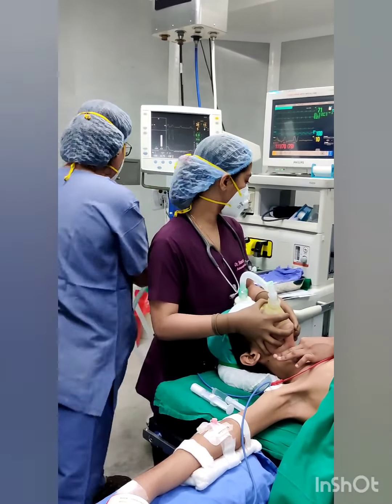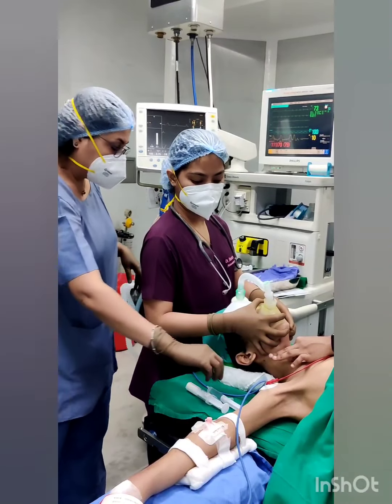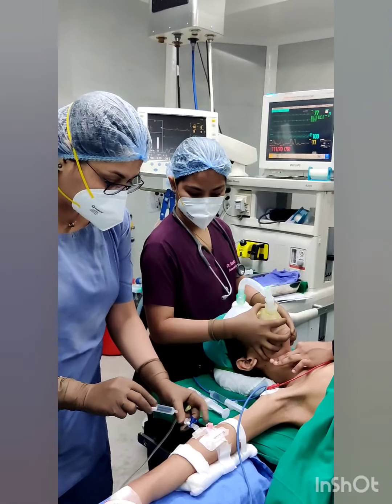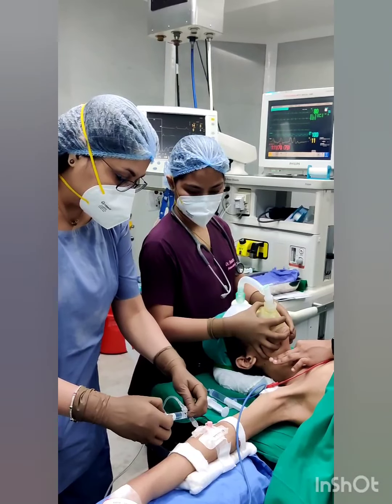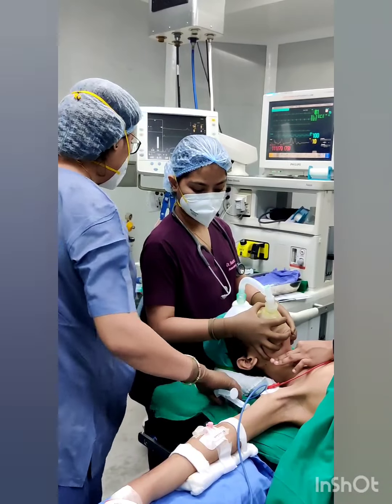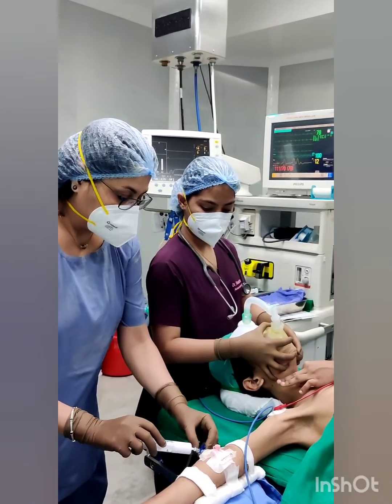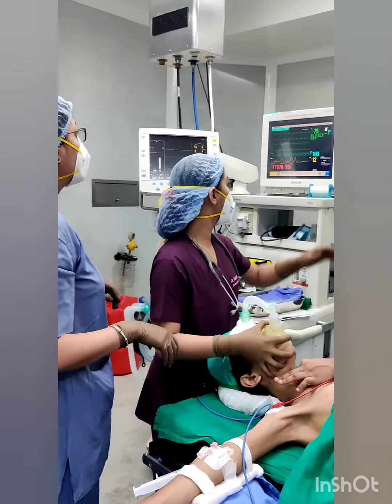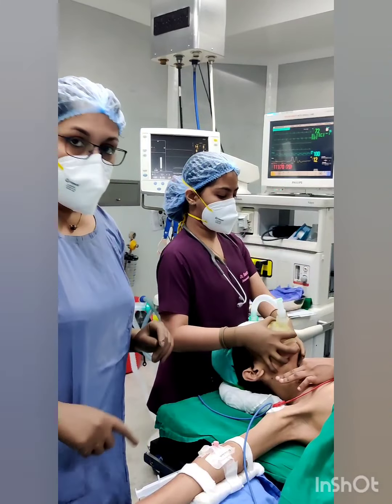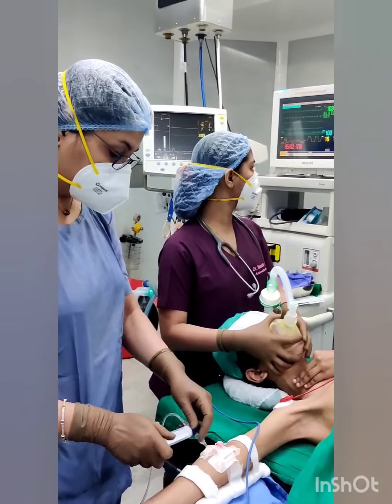In modified rapid sequence induction, after loss of consciousness, check for confirmation of ability to bag mask ventilate by a single bag mask breath before giving the IV muscle relaxant. Now, give the IV muscle relaxant, either IV succinylcholine or IV rocuronium, as in this case. Avoid further bag mask ventilation to avoid any air into the stomach. However, you can deliver oxygen by nasal prongs by passive oxygen insufflation in patients with poor respiratory reserve.